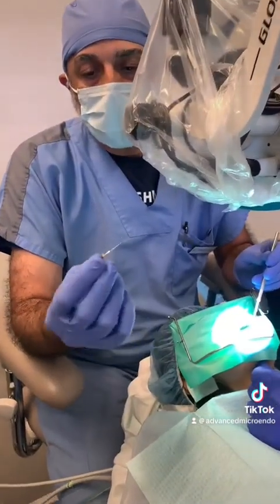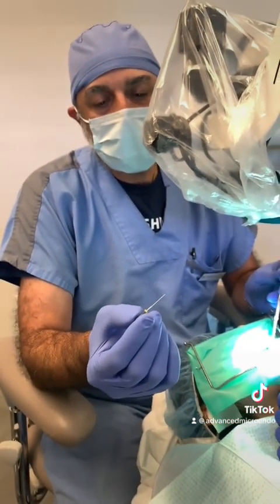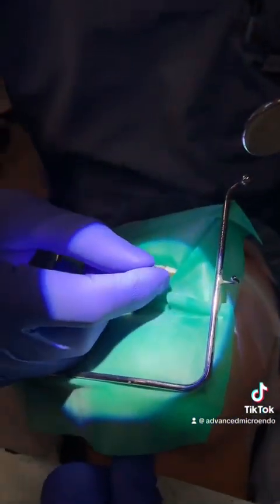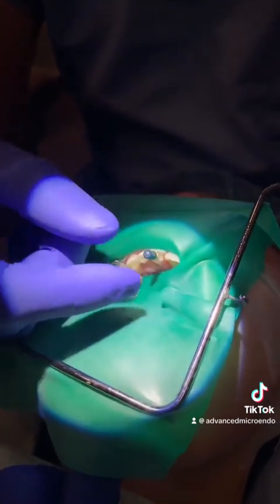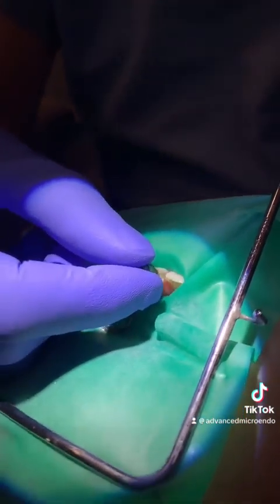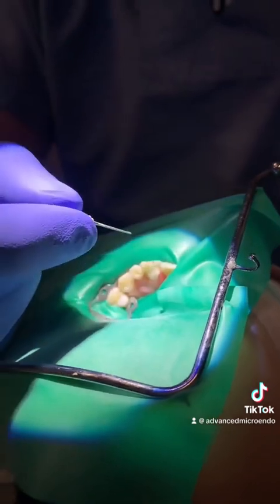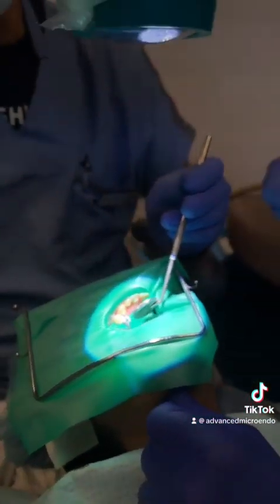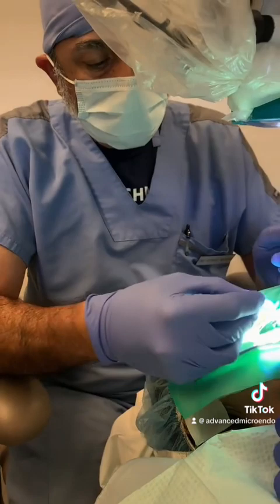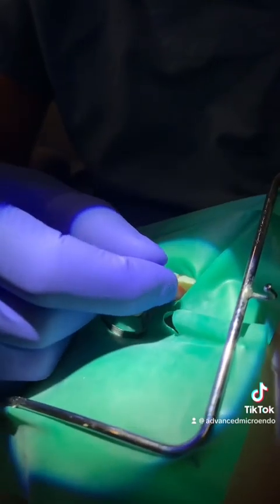I'm going to gauge the apical diameter. So this is a 60 file. My working length is 24 and a half. So I'm going to gauge the apical diameter to see. 60 is too wide, so the apical diameter is even more than 60, because the 60 goes to working length easily, and there's no apical binding of the file to the apical terminus of the tooth. So let's try a 70 file now, a stainless steel K file. Okay, 70 goes to length and it's binding.